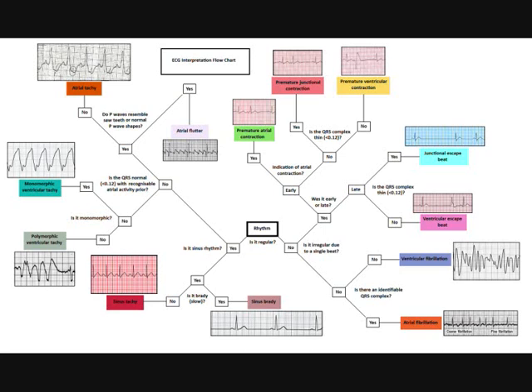Or is it continually, with no order — is it chaotic, is it irregular? So, no, it's not a single beat causing it to be irregular. We move on to: is there an identifiable QRS complex? It's not regular, it's not because of a single beat, so it's repeating, but there's no identifiable QRS complex. Well, that leads to ventricular fibrillation. I've color coded it, as well as giving it a small sample of the ECG of what it looks like to help visually represent that.